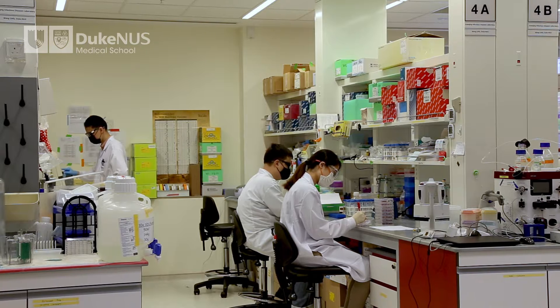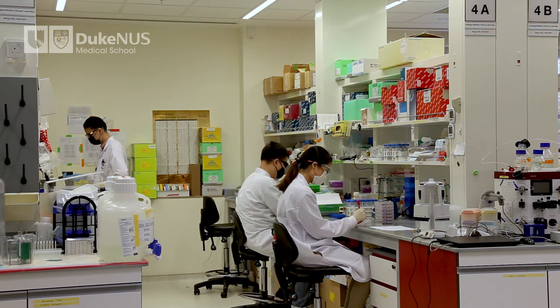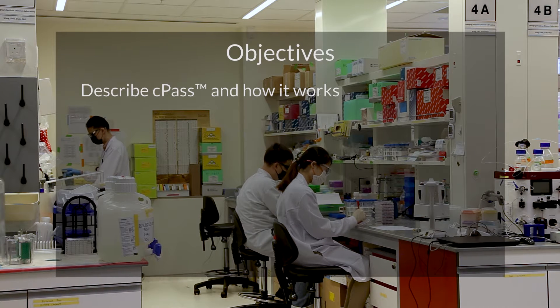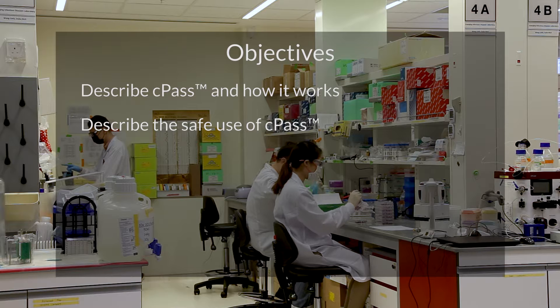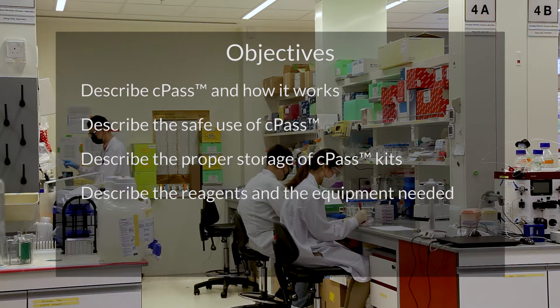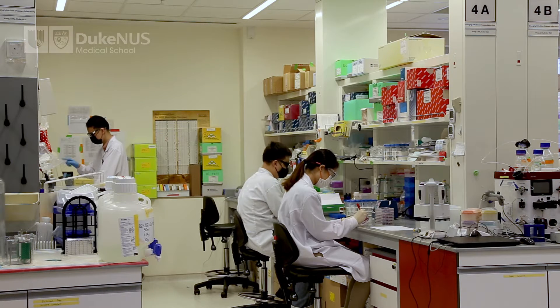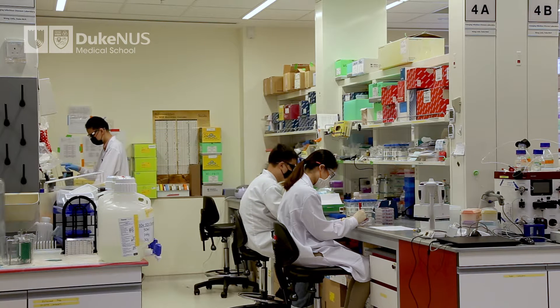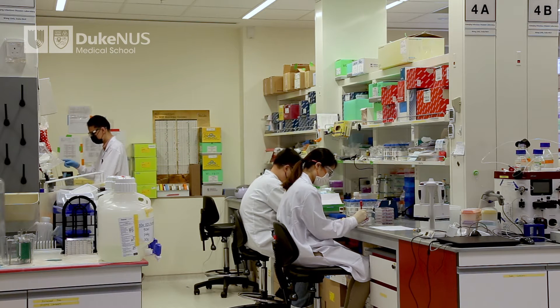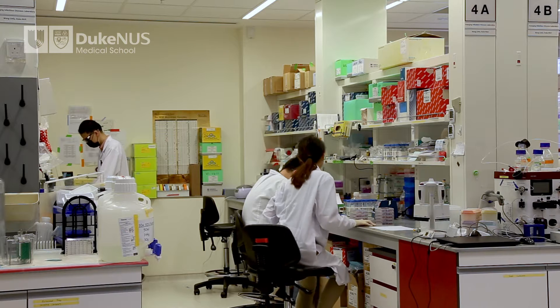This short video will show you how to run the SARS-CoV-2 Neutralization Antibody Detection Kit, or cPass. At the end of this video, you should be able to: describe cPass and how it works, describe the safe use of cPass, describe the proper storage of cPass kits, describe the reagents and equipment needed, and describe how to run the cPass test and interpret the results. This video is not meant to replace the instruction manual that comes with every kit. Please consult the manual when in doubt. The content of this video is mainly based on this manual.